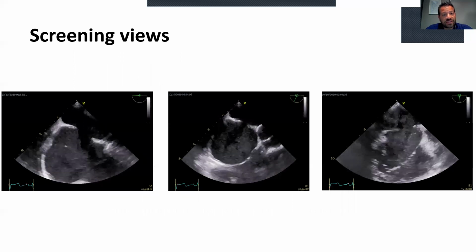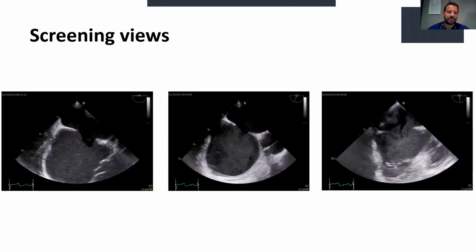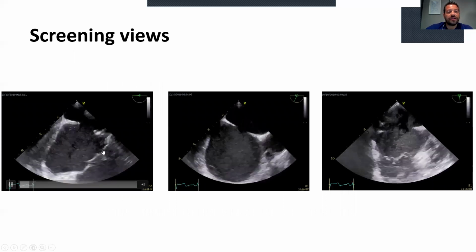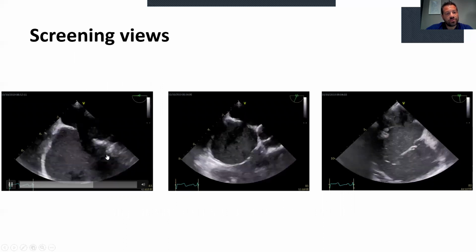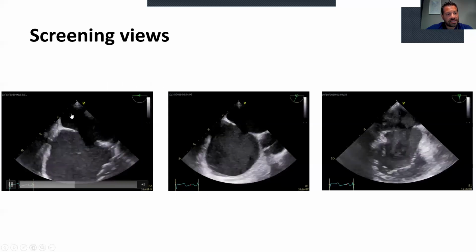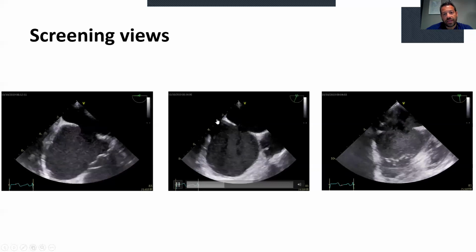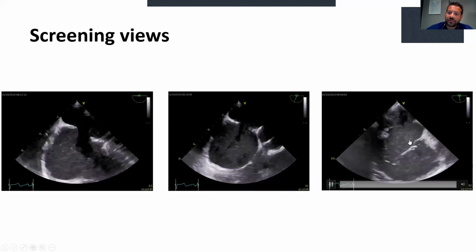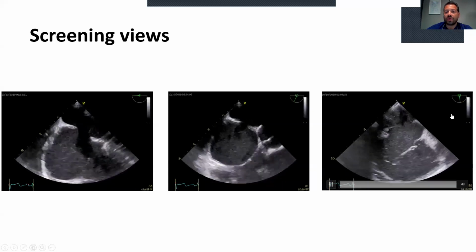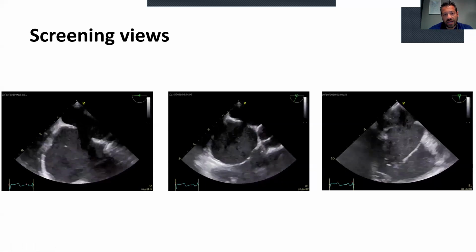We performed the transesophageal echo in order to check the atrial septal defect, and we saw that at 0 degrees, in 4-chamber views, we had a very nice atrioventricular rim here, a very nice pulmonary venous rim, we had aortic rim, we had posterior rim, and of course we had a superior and inferior vena caval rim. All rims were nicely visualized.